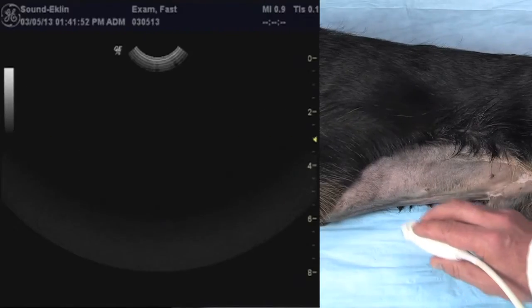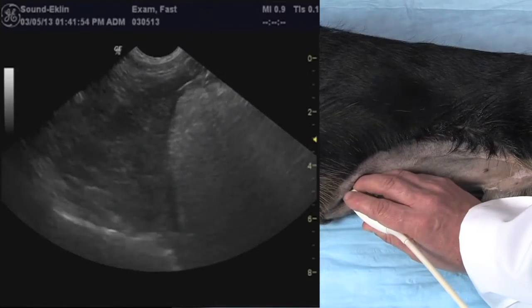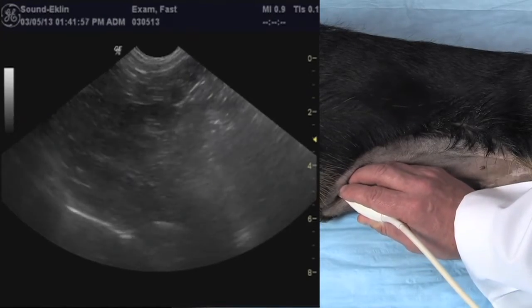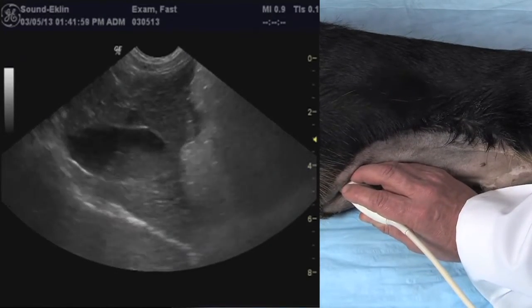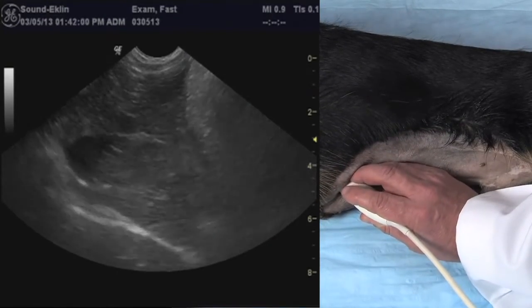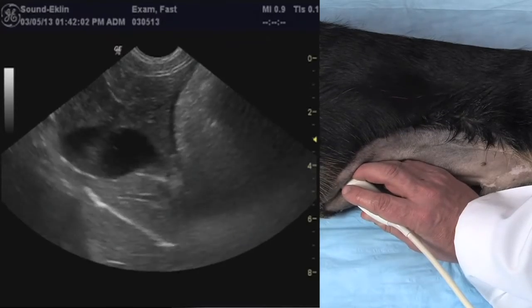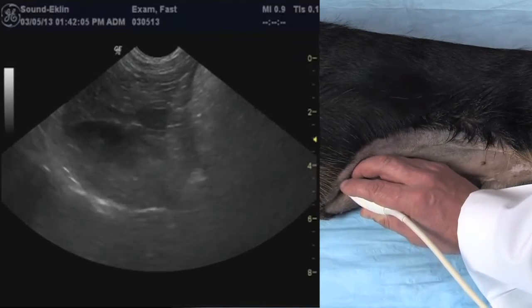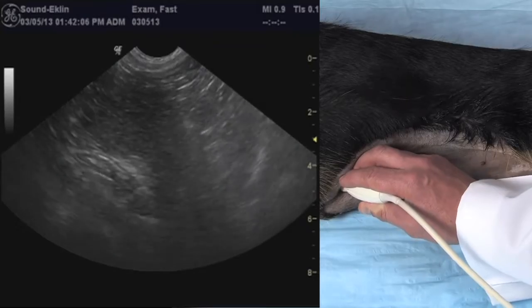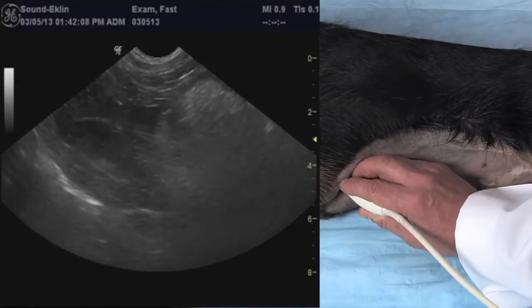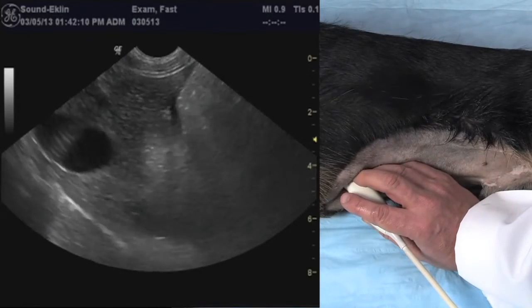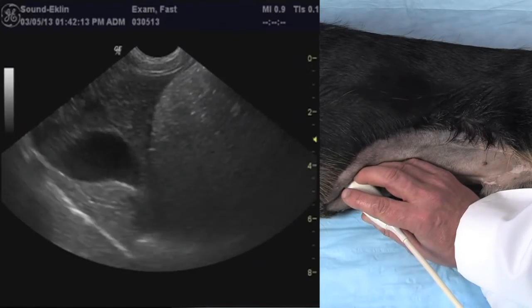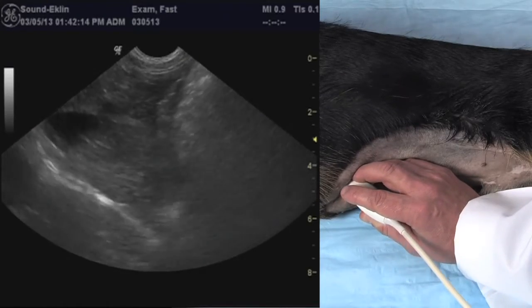To start with the DH view, the probe is placed at the sub-xiphoid area. In that region, what is imaged is the gallbladder kissing the diaphragm, as shown here. Once that landmark is achieved sonographically, we fan through liver lobes towards the table top and away from the table top, looking for free fluid. This dog is negative.